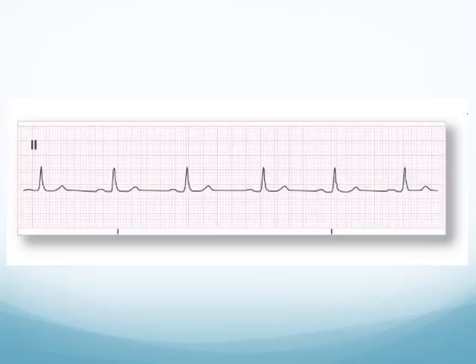Well, the only thing is, it almost looks like we can't quite see the P wave on this beat on the very far left, but we can assume that it's probably there since the rest of them are. Might need a longer strip to tell. We have P waves in front of each QRS. Our QRSs are of normal duration.